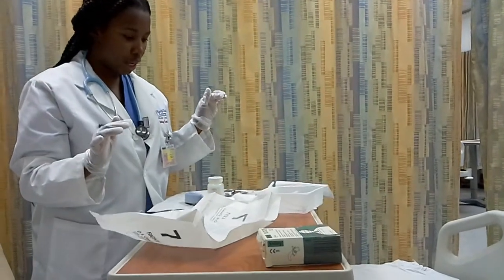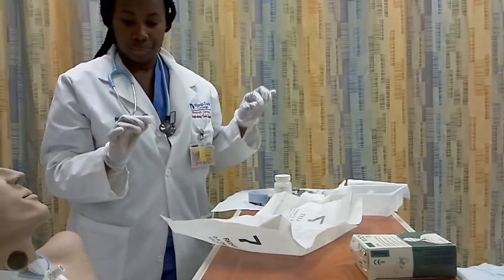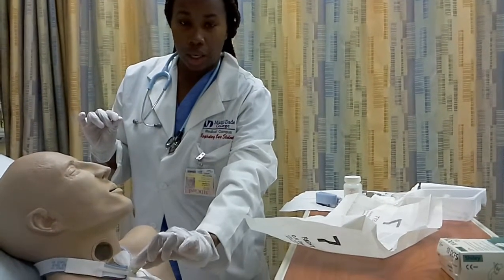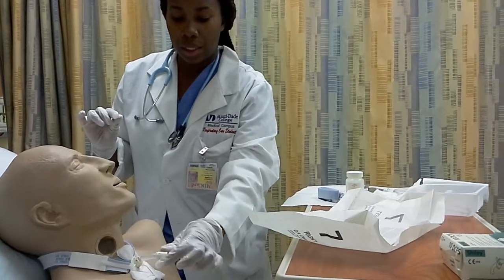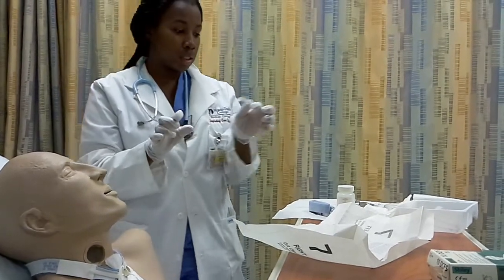I'm going to move my table. So this is my container. So what I'm going to go ahead and do is unlock the inner cannula. I'm going to take it out, making sure I don't touch this part because this is where the mucus is.